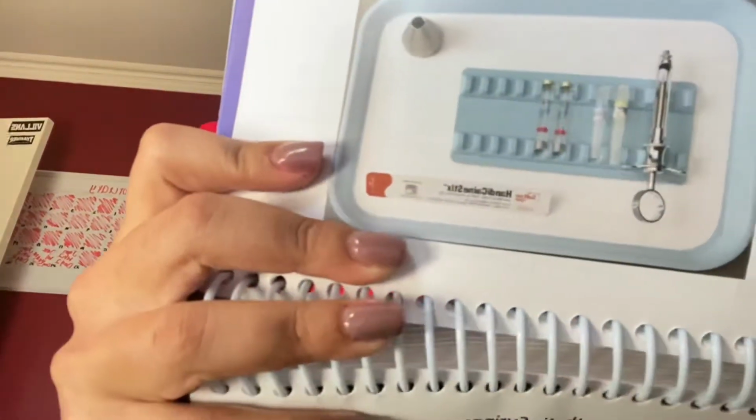We're first going to make sure that our patient has an x-ray up to date, a periapical x-ray. If they do, then that's fine. If they don't, go ahead and take an x-ray. Then we're going to administer a local anesthetic, which includes our cartridge, our needle, and then our syringe, which looks like this. That's the little setup.